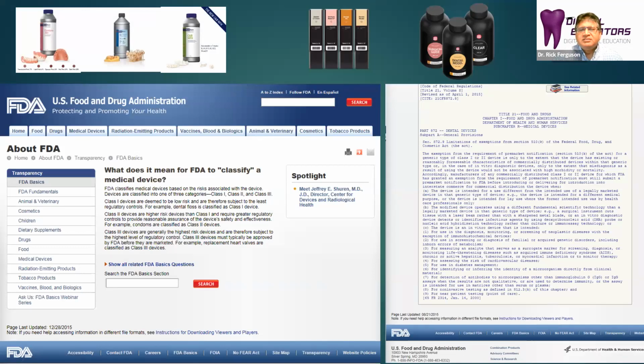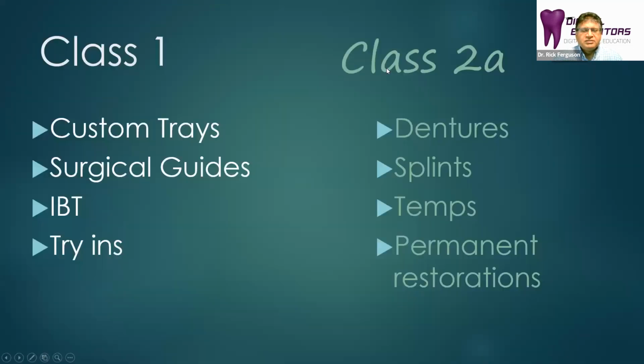One thing about these different resins is that you have to make sure that you are using FDA cleared resins, and of course all the resins, especially the ones that are going in the mouth, all the ones from SprintRay and Formlabs, and also the NextDent resins are FDA cleared, so keep that in mind. Of course, if you are printing just dental models and they're not going in the mouth, you can use some of the lower cost resins.